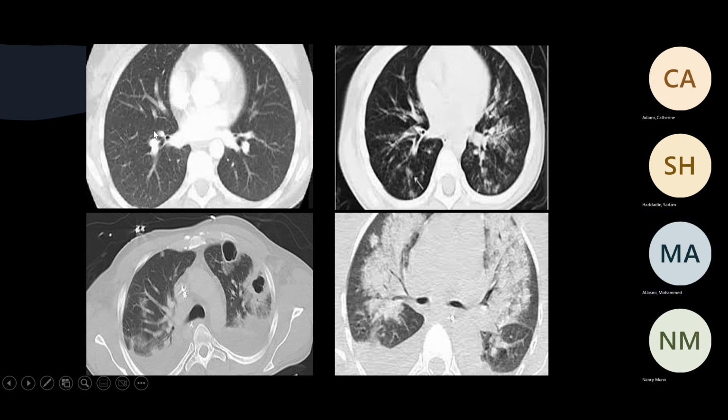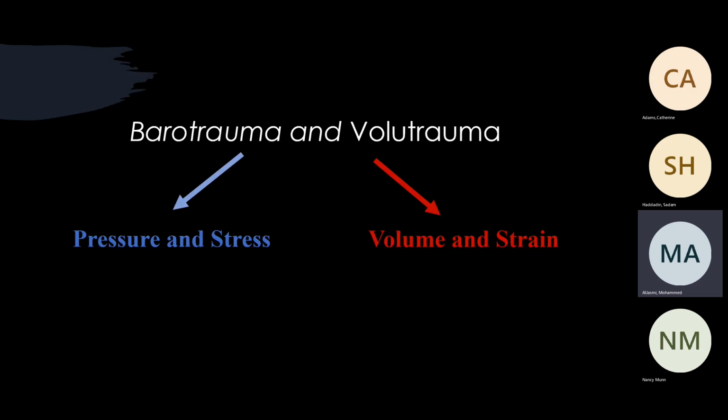Is that right? So the volume depends a lot on what disease you have, how bad your lung is, which is mainly the functional residual capacity of your lung. Unfortunately, none of us can know what the FRC is, because if I knew the FRC, it would be very easy to decide how much volume this patient will receive without any complications. And how can we do that?